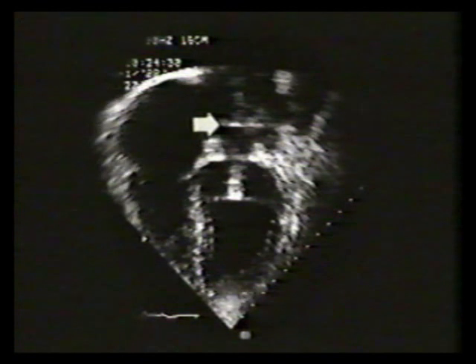From this image, the ball appears to be elongated with a large portion outside the cage in the left atrium. The ball is displayed like this because echocardiographic instruments are calibrated to measure distances according to the speed of sound through tissue. Since the speed of sound propagation through the prosthetic material is significantly slower than the speed through tissue, the poppet is displayed with this artifactual elongated appearance.